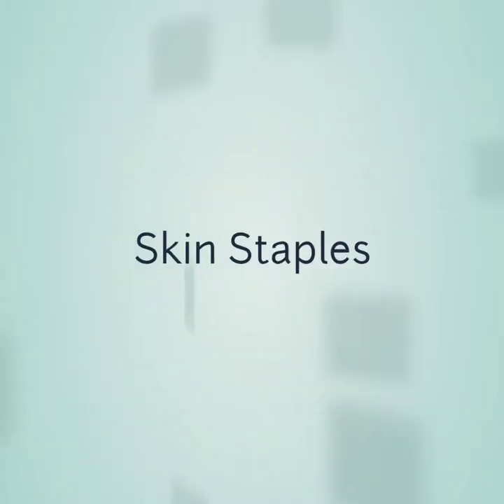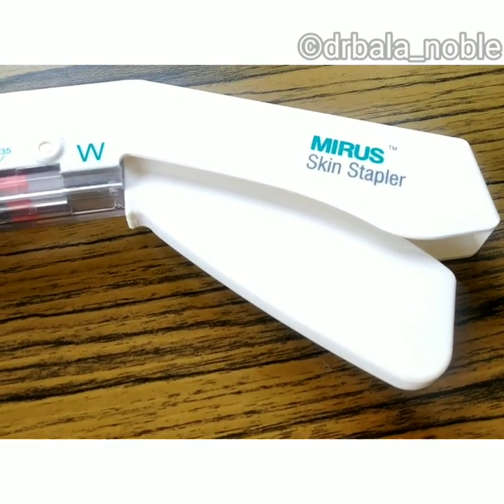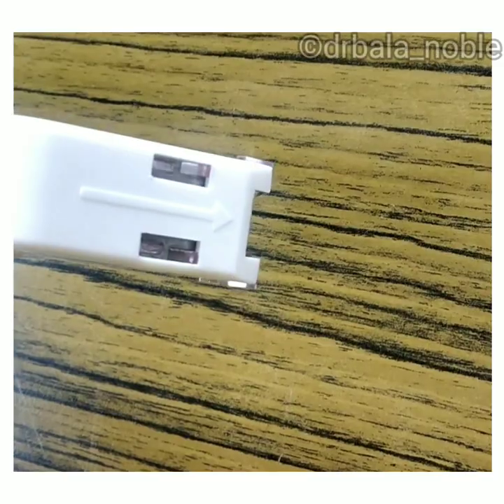Hello everyone. Now I am going to show you how to apply and remove skin staples. This is a skin stapler, generally made up of plastic and loaded with disposable surgical staples. This one has 35 staples.